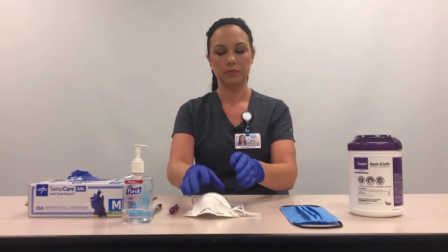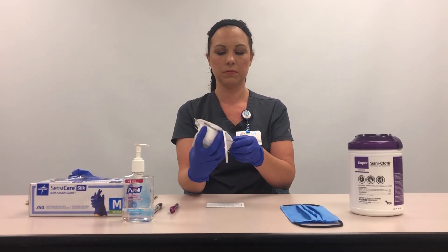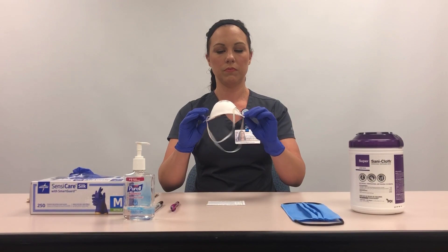Inspect the respirator for damage. If there is damage, discard and replace.